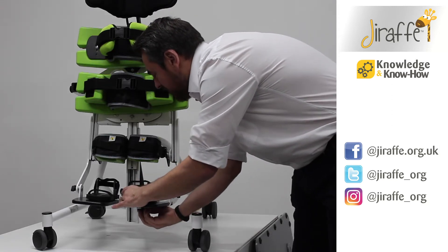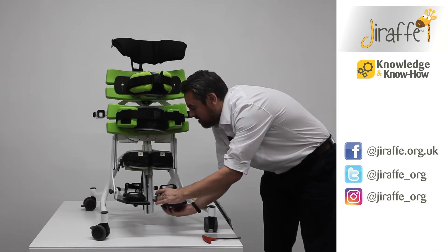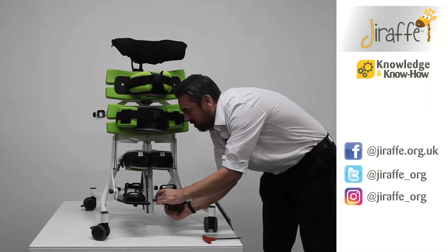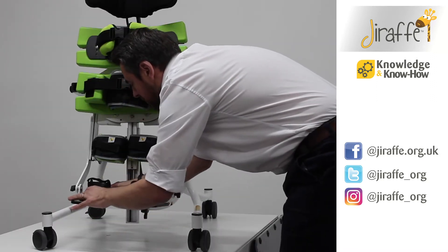Turn the sandal round — we can fine tune the placement of the sandal when we have a child there to adjust against — and then lock back down into position. Do the same with the other sandal and lock down into position.